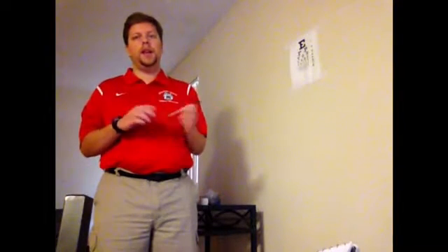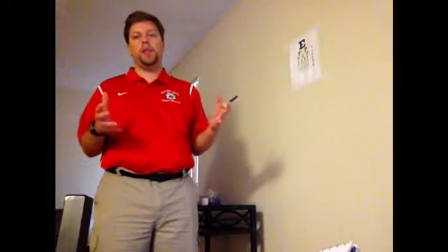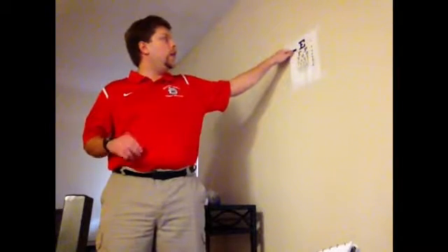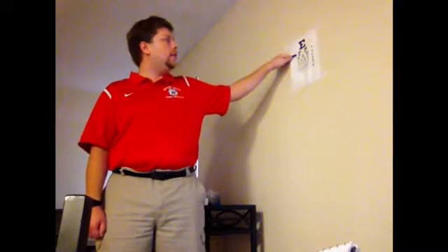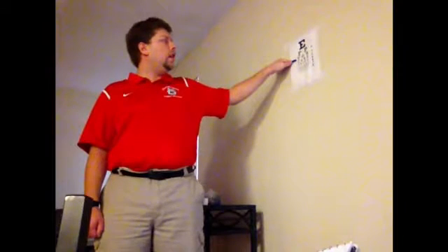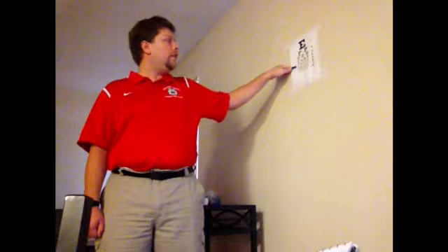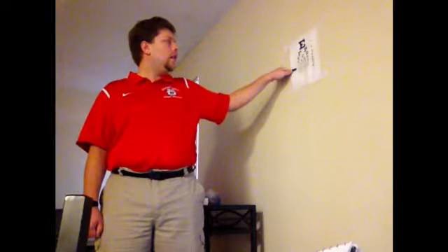That's how it translates. Now we're just going to test both eyes together to get a comparison. So go ahead, and you're just not going to cover either one of your eyes. We're just going to walk through the same test, okay? Okay. Go ahead and read line 1. E. Line 2. FP. Line 3. TLZ. 4. LP ED. 5. PE CFD. 6. ED FC ZP. And then line 7. FE LO.